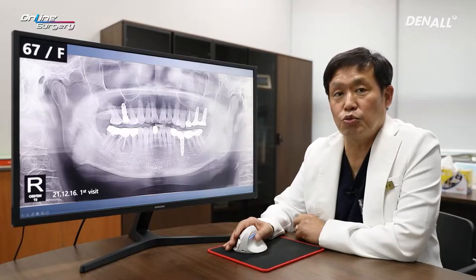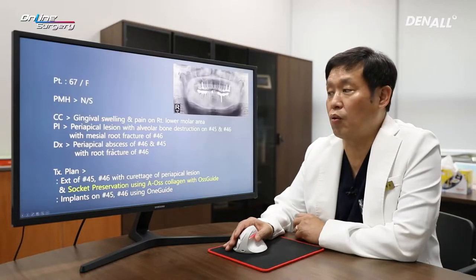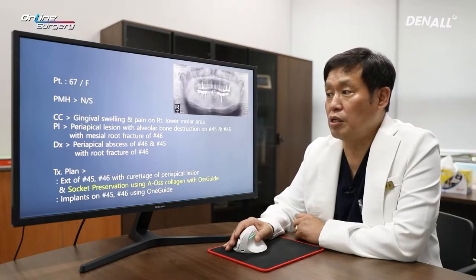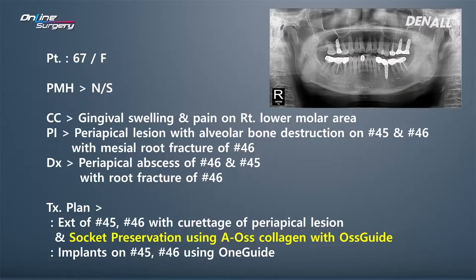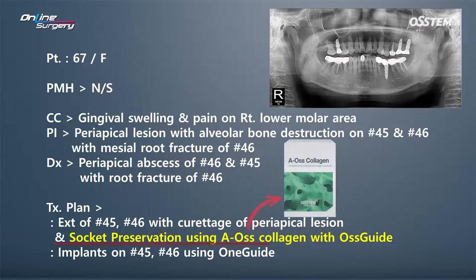The plan was to extract numbers 45 and 46. Because alveolar bone destruction was significant, AOS collagen was to be used for socket preservation.